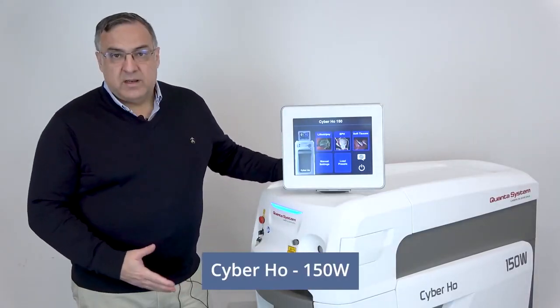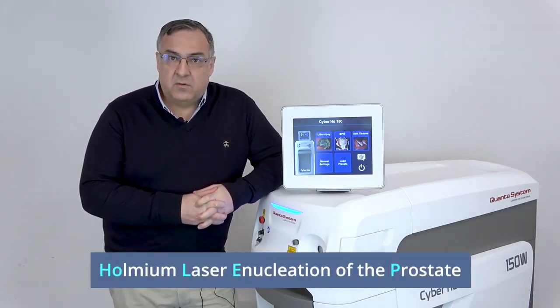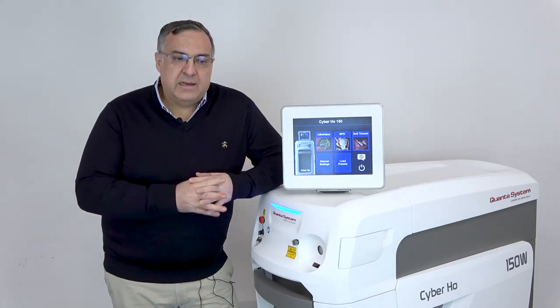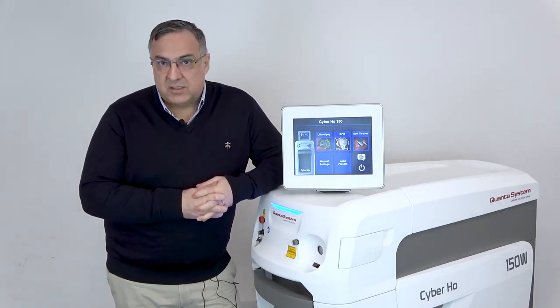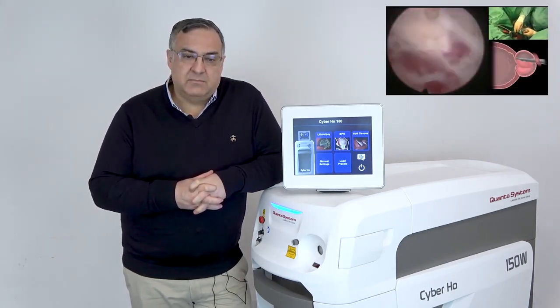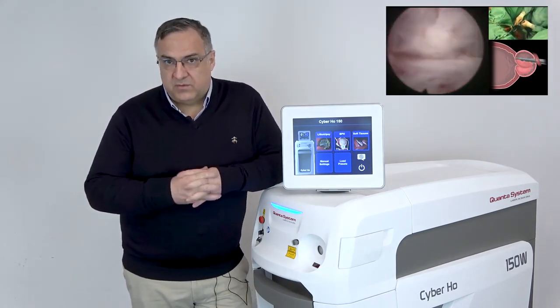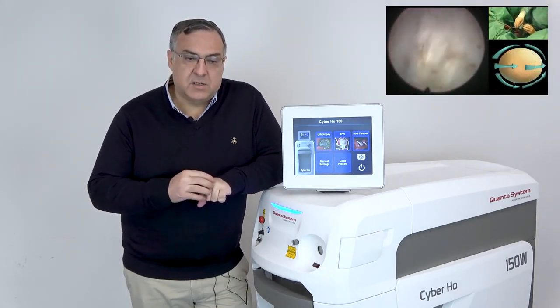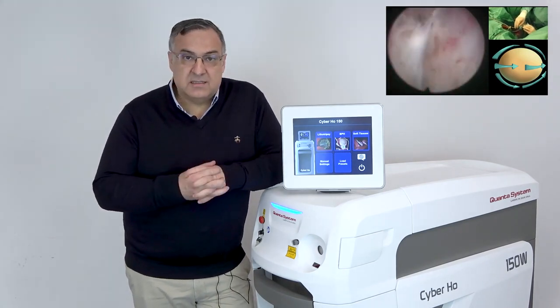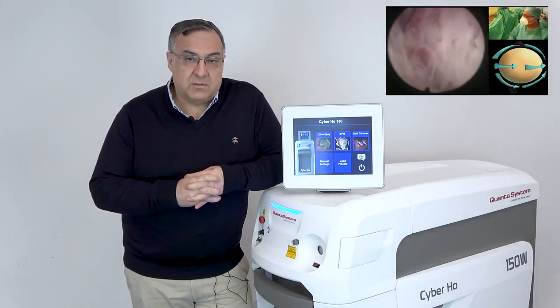This is the Cyber Holmium 150 watt laser and it's used for HOLEP — the acronym for Holmium Laser Enucleation of the Prostate — which is the treatment we love and is becoming the standard for BPH. I started using a green light laser for enucleation at the beginning, but I soon realized that Holmium laser is probably the best tool. It helps you dissect the plane and at the same time produces hemostasis, with very little mechanical effort.